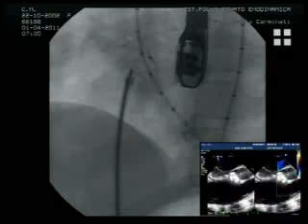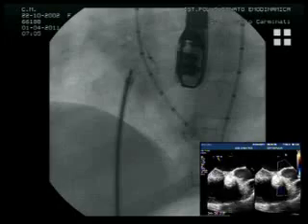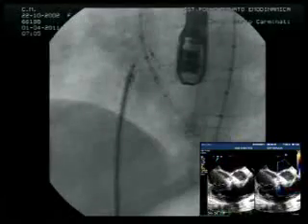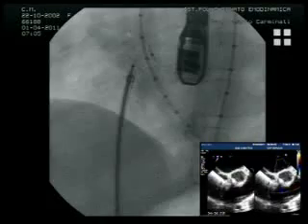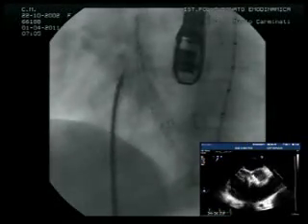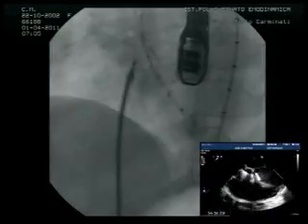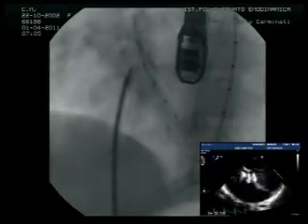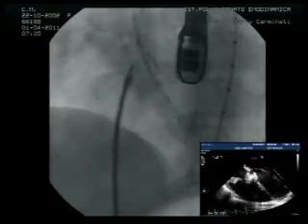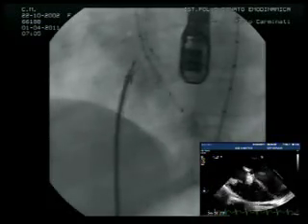Sometimes the muscular umbrella with a 7 millimeter stent between the umbrellas is a little bit too long, so that you have to be careful not to involve the tricuspid valve. Well, the tricuspid valve is not involved. Dietmar, I think we are ready to release the device. Wonderful. Hopefully you don't need any special projection to release the device, right?